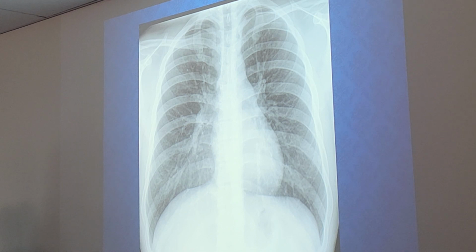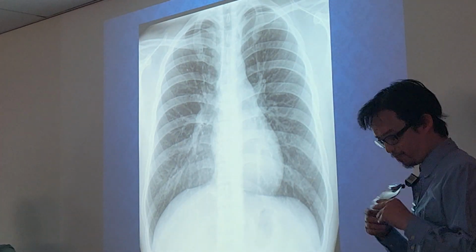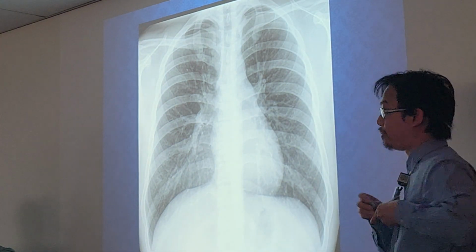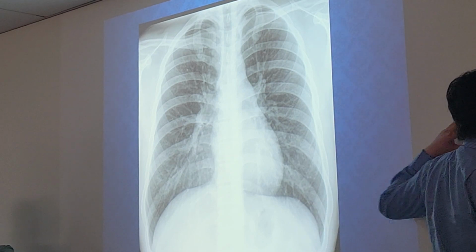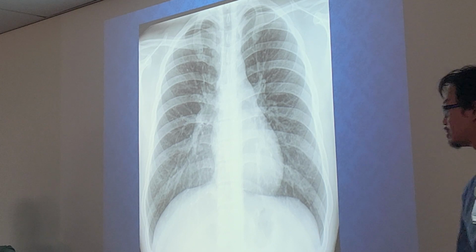Exactly. If the marker is PA, when you flip it, now the marker looks AP. Just like when the chest is PA and you flip it, the chest looks AP. So this marker was placed PA. I thought it would appear as if it was the other direction, as if you have a marker, right? Oh, and your marker is PA, and then you flip the whole image, it's going to look AP. So the marker's fine.